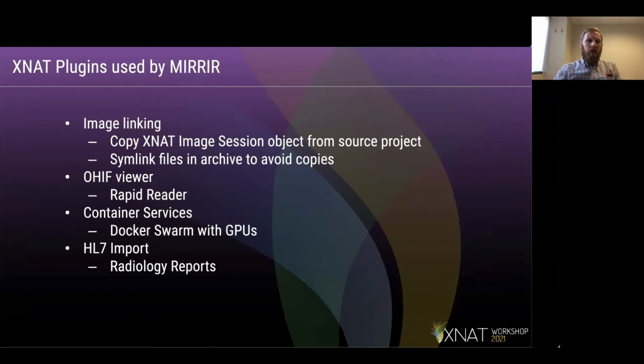I talked about the image linking plugin already. And we used the OHIF viewer extensively, and Dan has mentioned Woon Chan's Rapid Reader, which is just a nice focused way. From an administration perspective, you can limit what people are looking at and doing, and it's also a nice focus for the individual reader, to define a work list that you go through instead of having to click around in a broader UI.